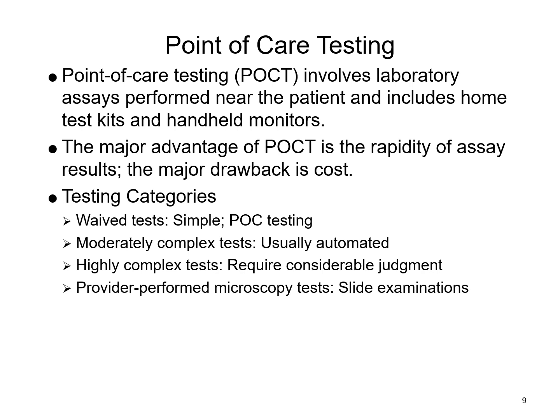Now, test complexity itself is based off of FDA standards, and it's determined by specific criteria that assess knowledge, training, reagent and material preparation, operational techniques, QC and QA characteristics, maintenance, troubleshooting, and interpretation and judgment of the particular test. So anything that gets approved by the FDA, they assess these criteria and then determine which category to place those tests into.